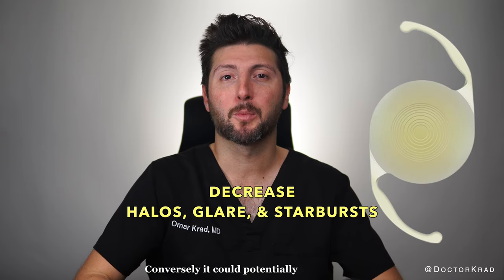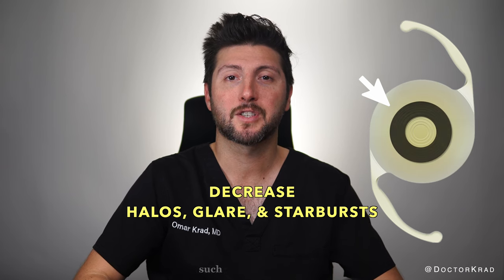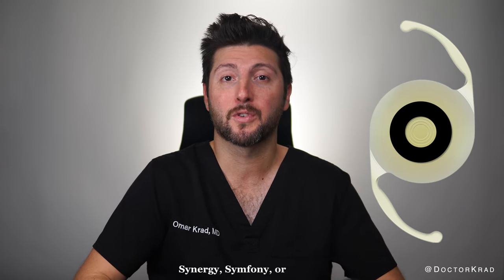Conversely, it could potentially help reduce dysphotopsias of diffractive multi-focal lenses such as the Panoptix, Synergy, Symphony, or Restore.